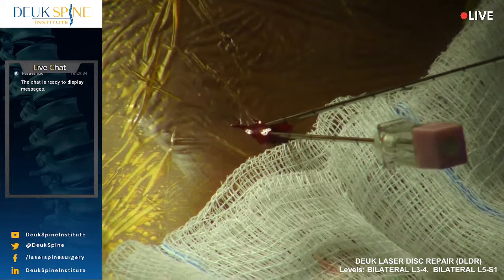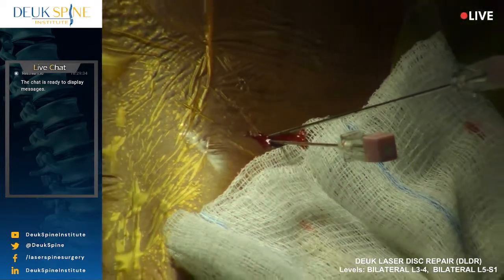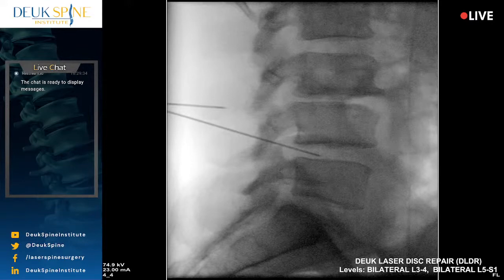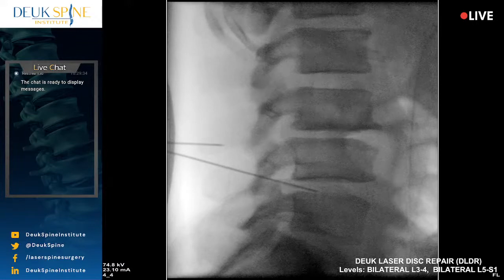But now we're going for 3-4. Can you show us 3-4? A little better. It looks like we got some orbit, maybe a degree of orbit we need to fix, and possibly some wag. So the orbit's good, we just need to fix the wag now. Basically, we're using an x-ray machine to navigate, and to do that, we need to make sure the x-ray machine is quote-unquote calibrated. That's really good there, Jordan. That's perfect. Thank you for doing such a good job.